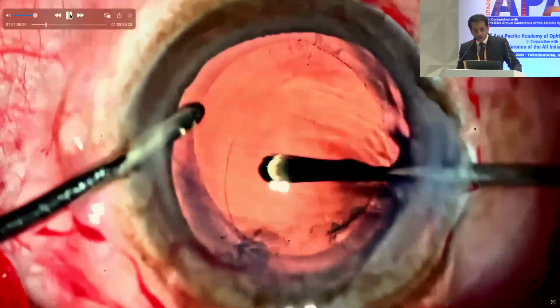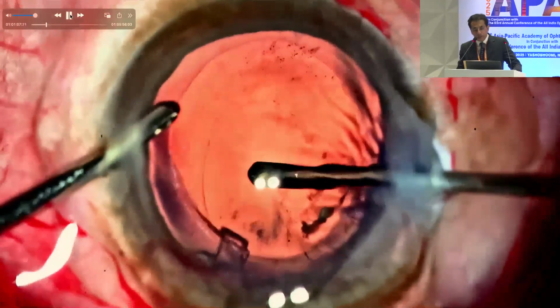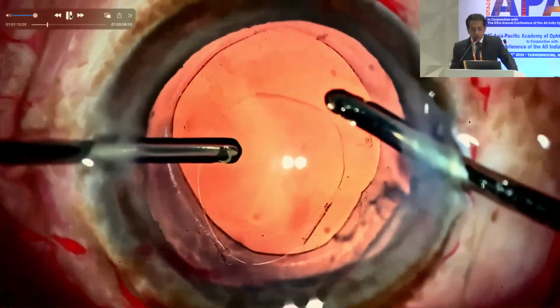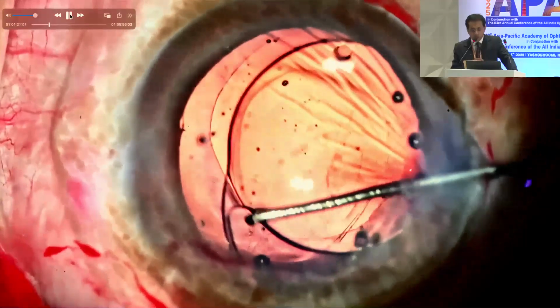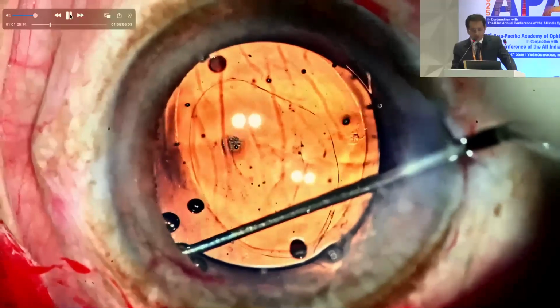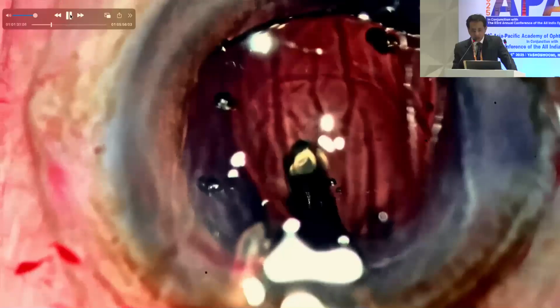The reason we perform the rhexis earlier is that it is much easier in an eye which is not evacuated of vitreous, because vitreous gives us support. If the eye has become soft, it becomes a little tricky to perform the rhexis. When you do a posterior capsular rhexis, inflating the bag and placing the lens will be safer. Otherwise, we would enlarge the rhexis while maneuvering the lens into the bag. Because we have a very strong rhexis, you can place the rigid PMMA lens into the bag without any extension of the rhexis.